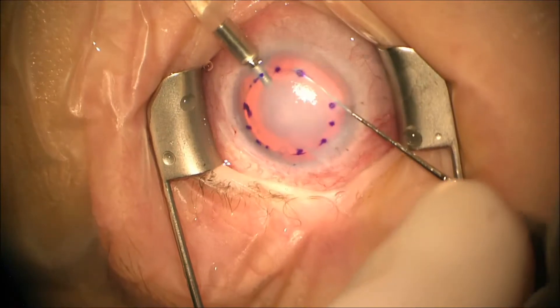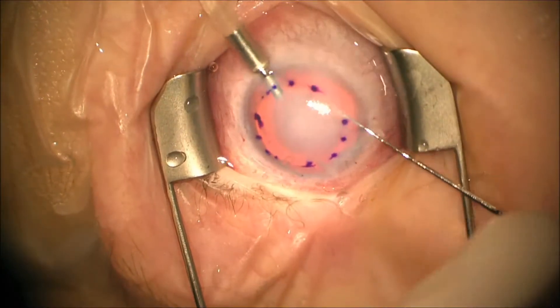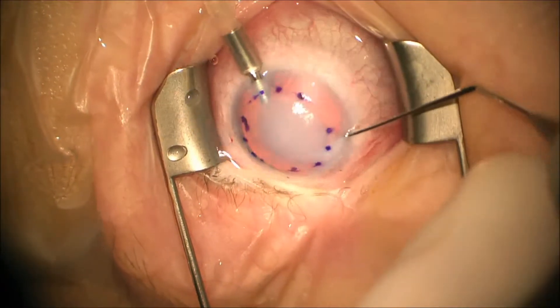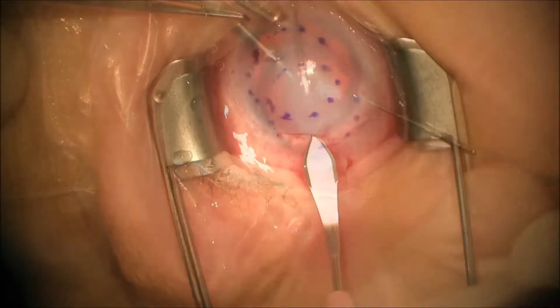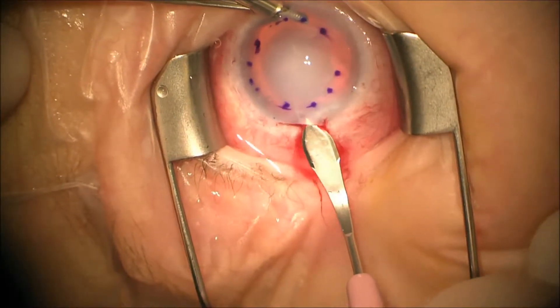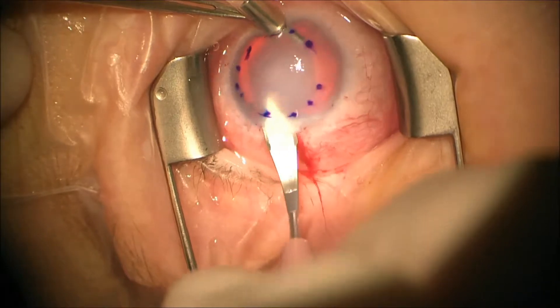We use a reverse Sinsky hook here to score the endothelium in the area in which we're going to try to remove it. As this patient is so young, it's very difficult because Descemet's membrane is so densely adherent to the cornea to actually perform a full stripping maneuver.